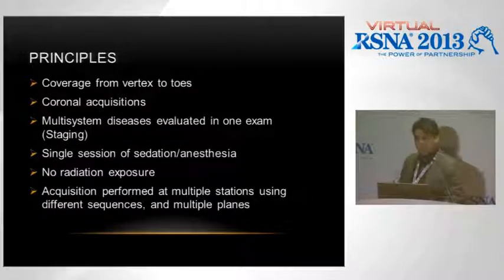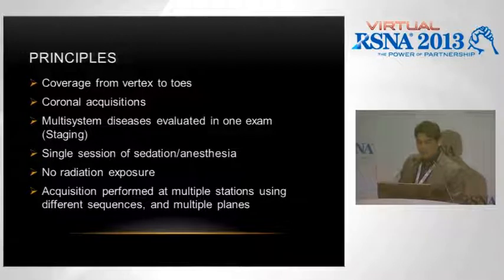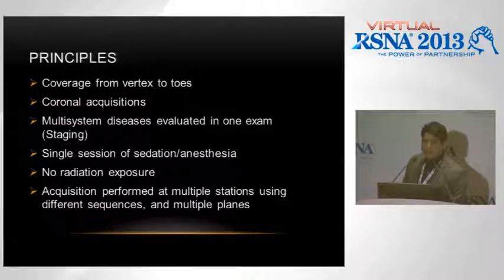Most of the multi-system diseases can be evaluated in one exam from a standpoint of staging. Clearly, we saw that with the lymphoma cases. And then all of this can be performed in children in a single session of sedation, which is key. And clearly, we all know that it's the radiation exposure that's driving a lot of our MR applications. And just like we had mentioned earlier, the acquisition is performed at multiple stations using a lot of these sequences.